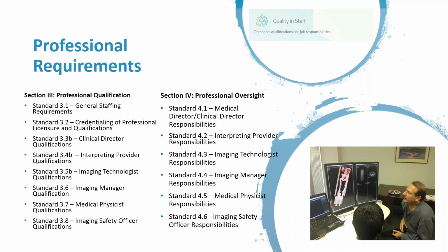One of the complicating factors in developing the standard is that the way people are credentialed in the field of dentistry is not the same as it is in medicine, and ConeBeam is applicable to both. And so we've had to be cognizant of the way things happen in the dental world, while also supporting the way things happen in other worlds, such as the ENT world, and worked to handle both worlds at once. And this has been reflected in our continuing education requirements and our training requirements, and even in our language, talking about, for instance, a clinical director in this world rather than a medical director, with the understanding that it's not necessarily a physician.